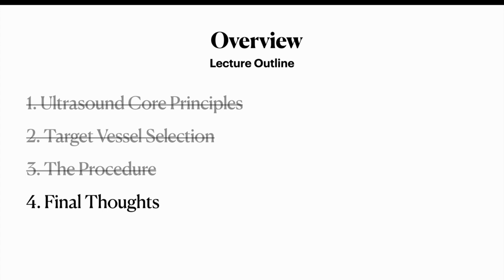And that's it. We've basically covered all the key techniques that I can teach you for a transverse approach for ultrasound guided IVs. But now just a few final thoughts. Number one is that the details matter. When I first learned this procedure, I thought I had a good understanding of what I was doing. I knew how to map my vessels, I knew how to insert my IV, but I made mistakes with my setup, and I made mistakes with, once I got my flash, trying to thread the catheter immediately without flattening and slowly advancing the needle.